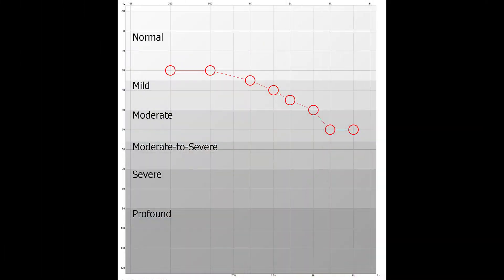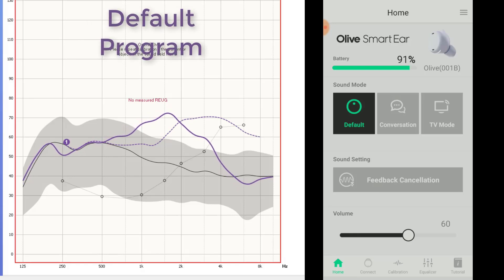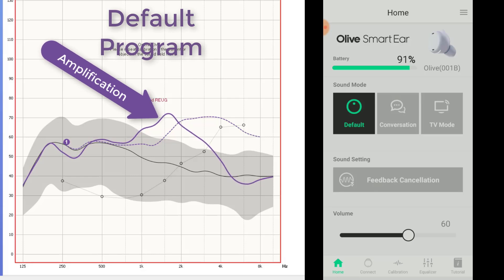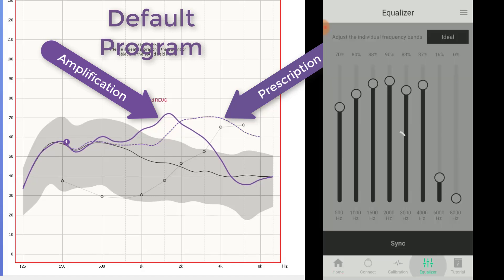To test this product, I used Real Ear Measurement — an objective measurement to see the output of this device relative to a NAL-NL2 hearing loss prescription for a common high-frequency sensorineural hearing loss in my right ear, as indicated on this audiogram. I first tested each preset program in the app, starting with the default setting at a volume of 60%. I'm looking at where the amplification is applied, indicated by the solid purple line, and how close that line is to the prescriptive target for a mild high-frequency hearing loss, indicated by the hashmark line. Note that all hashmark prescriptive target lines will remain the same across each test.